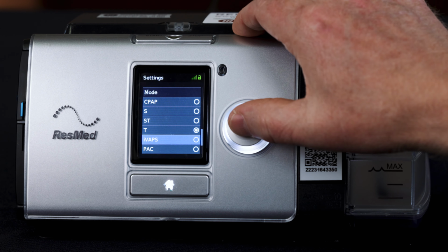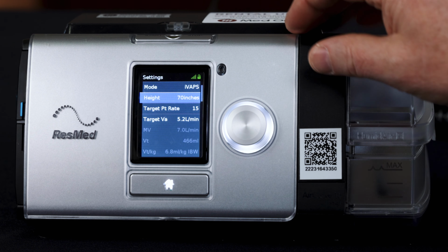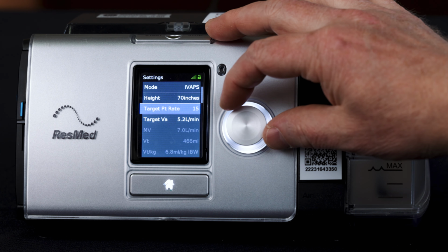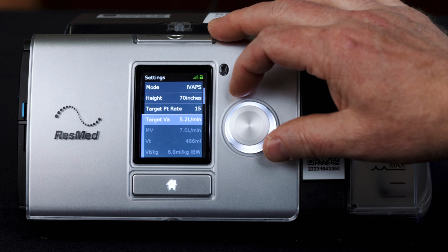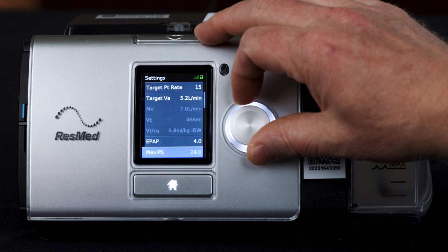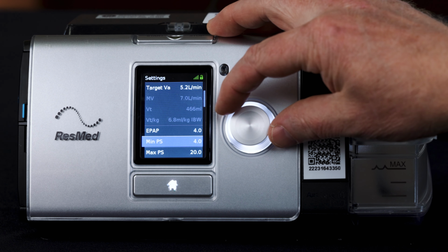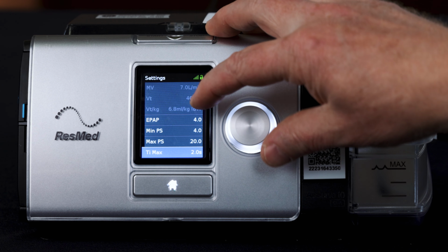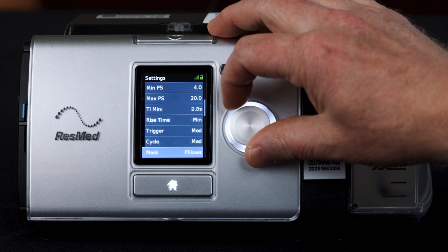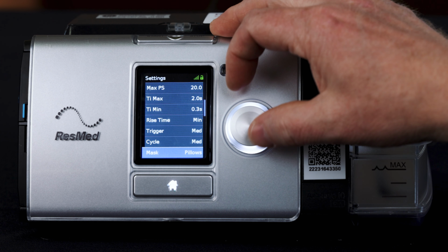Then you have iVAPS. Based on the physician's orders, you'd put in the patient's height, put in the target patient rate. Then you want the alveolar ventilation set. Typically, you would always set it 7 or below. And then again, you go down to EPAP, which is the expiratory pressure, set that according to the physician's orders. Minimum pressure support, maximum pressure support. And then again, you have your mask type. So the interface again is pillows, full face, or nasal.